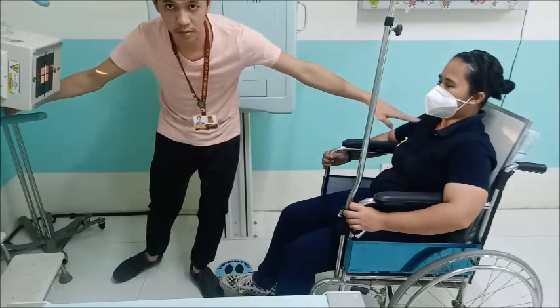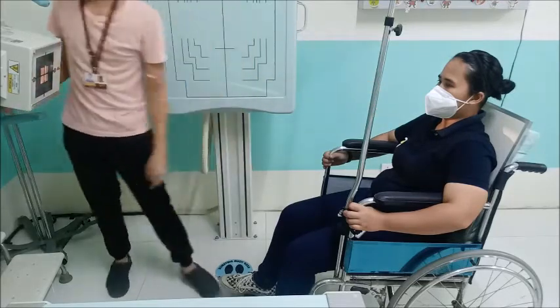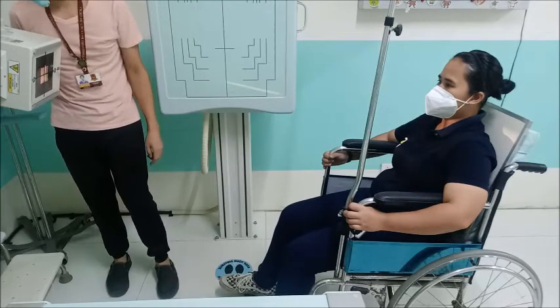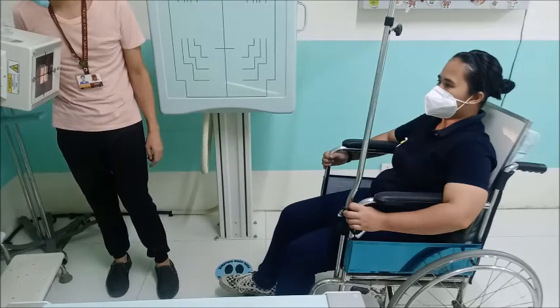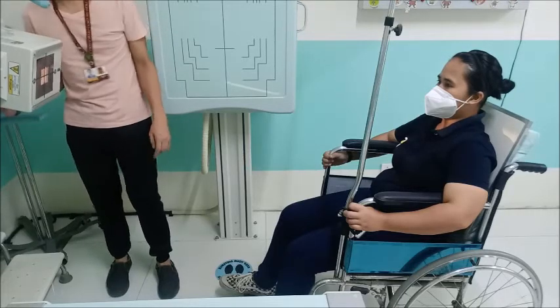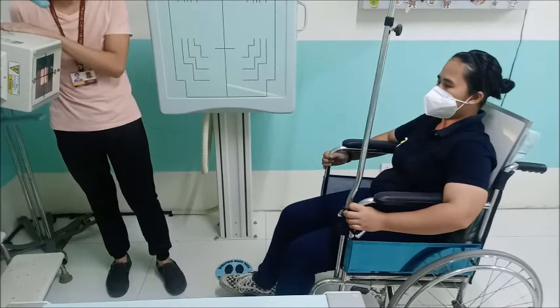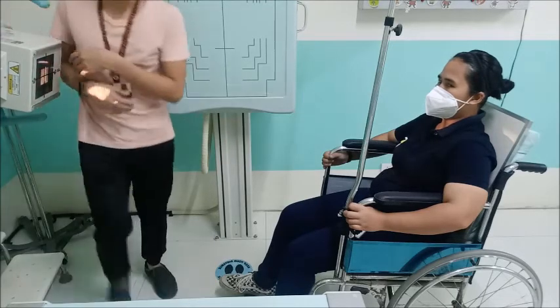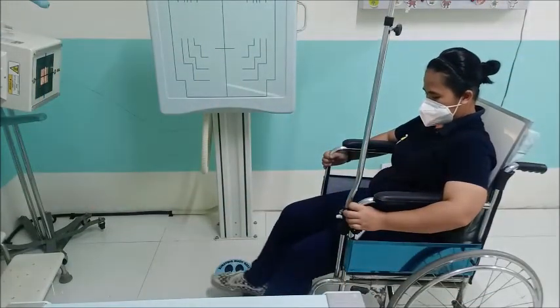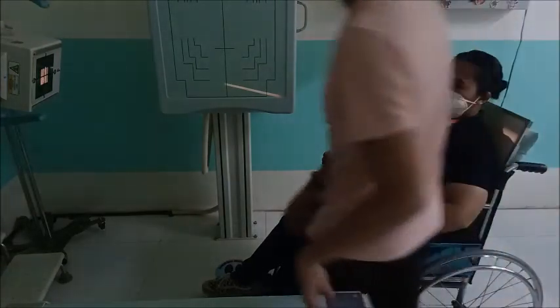The shoulders are still included, with the border at the top. And of course, the central ray direction is the same, approximately at the level of T7. I did not adjust the collimation. Again, the size of your cassette should also be the size of your collimation, not too much.